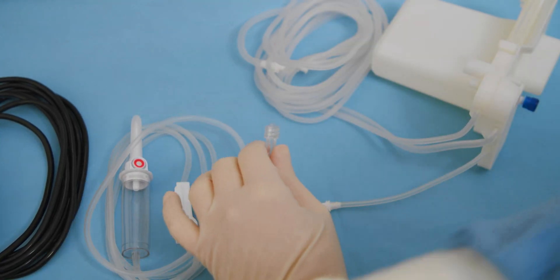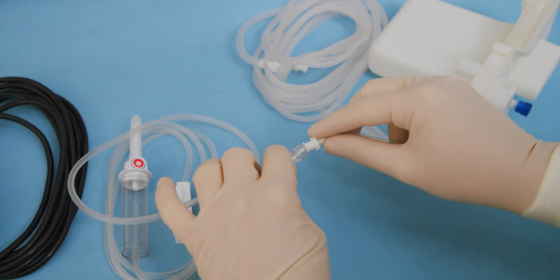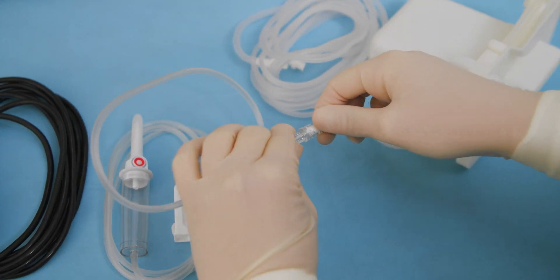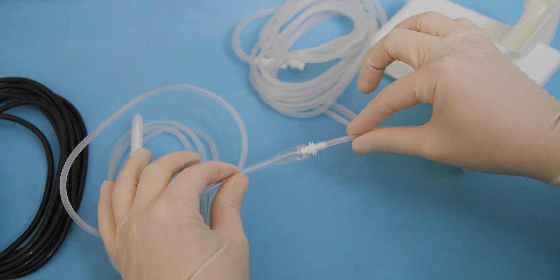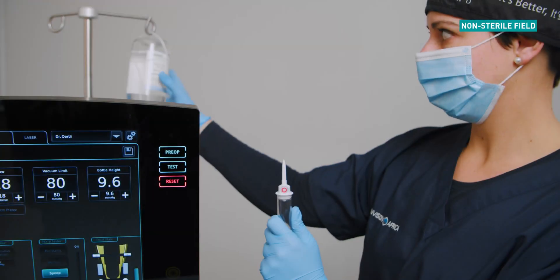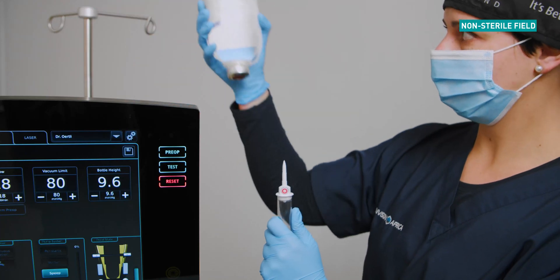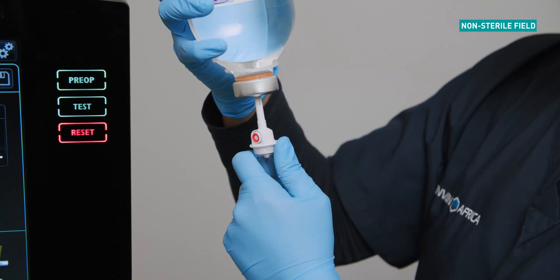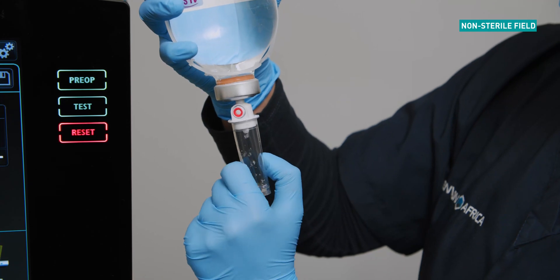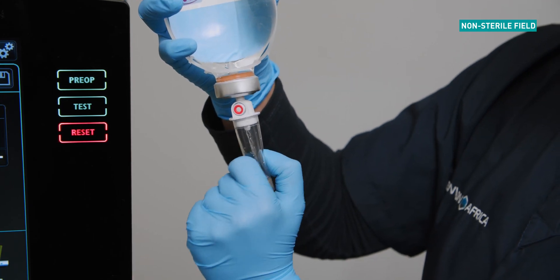Connect the admin set to the infusion port of the OS 4 set. Connect the infusion set to the BSS bottle. Fill the chamber halfway with BSS by squeezing.